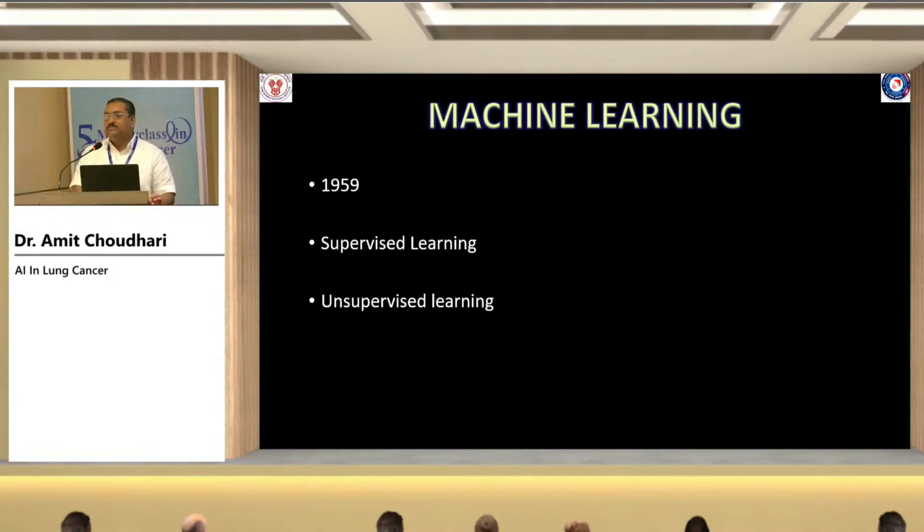By supervised, we mean we have a training data set which has a known starting point and a known endpoint, and then the machine is trained with this known endpoint, which is considered to be the ground truth, and then the machine learns what the expected endpoint would be, and subsequently the computation goes on into the validation phase for generating these endpoints, where the endpoints of the rest of the validation data are not really known.